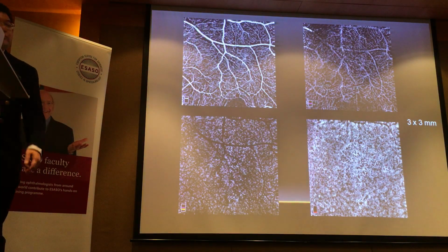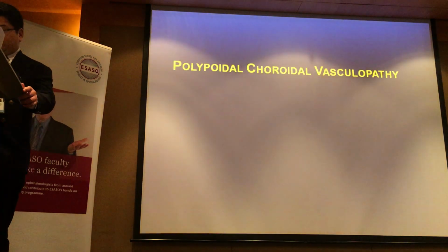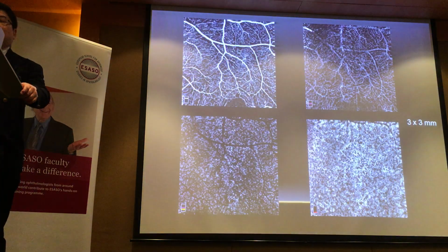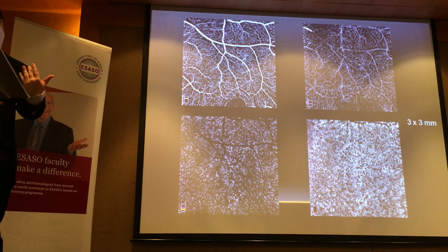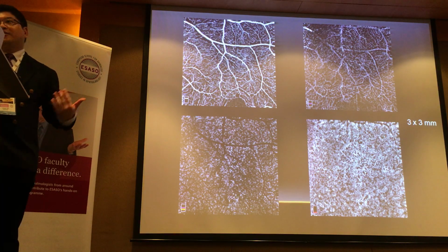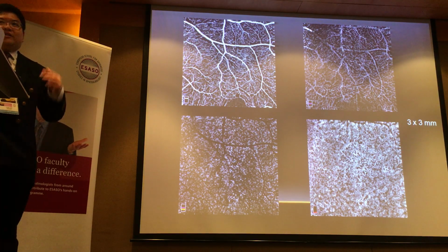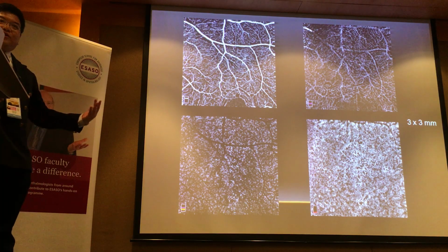So it's important to know the range of your OCT scans. So we steered this upward. You can see the fovea is down here now to cover that region. And we found that there was no activity. So it's a bit more reassuring. Frankly, clinically, based on my judgment, I would have said CSCR. Even if it's AMD, it's very low activity, I would have watched it. But this gives an extra reassurance.